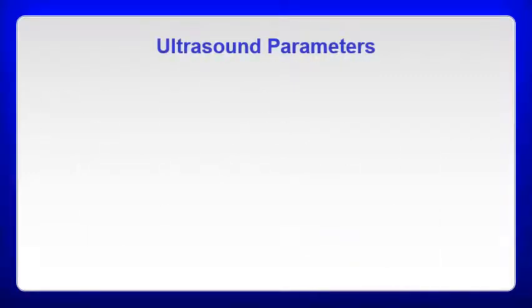So, ultrasound parameters. This is kind of the key point when you're actually utilizing ultrasound. Whenever you're coming up with an ultrasound treatment, you're going to be essentially setting 4 different parameters, and it's all going to be based upon what your goals are, where the tissue is located, and what it is you're trying to accomplish.